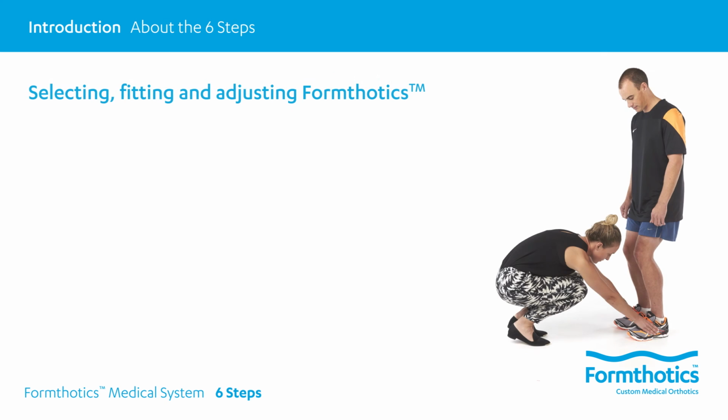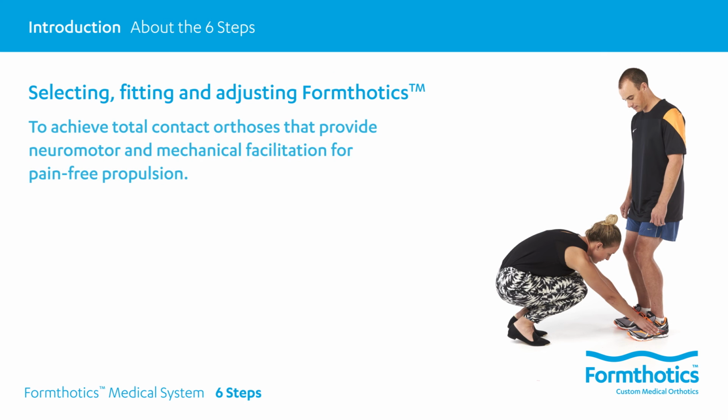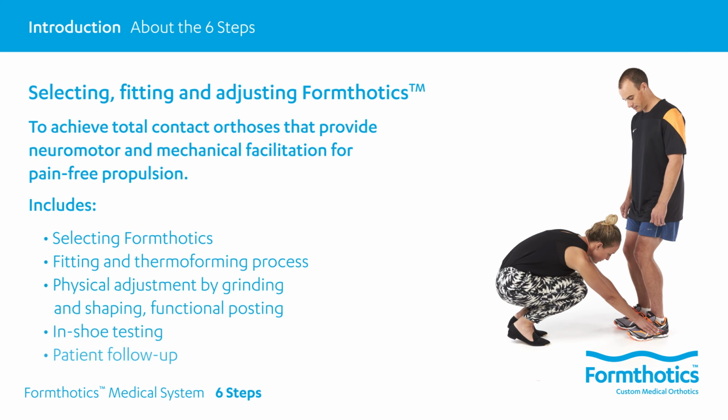The 6 steps are easy-to-follow steps to create total contact foot orthoses in your clinic, providing your patients neuromotor and mechanical facilitation for effective and pain-free propulsion. The 6 steps include the selection of the best Formthotics model, the thermoforming and fitting process, the physical adjustment of the orthotic by grinding and shaping, functional posting, in-shoe testing, and lastly, patient follow-up.